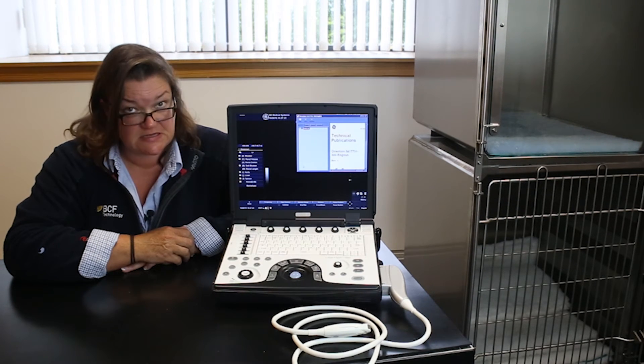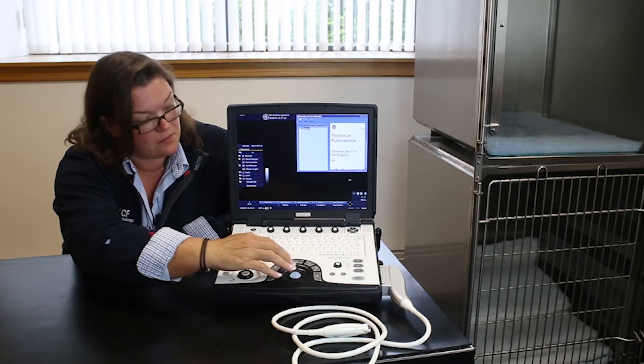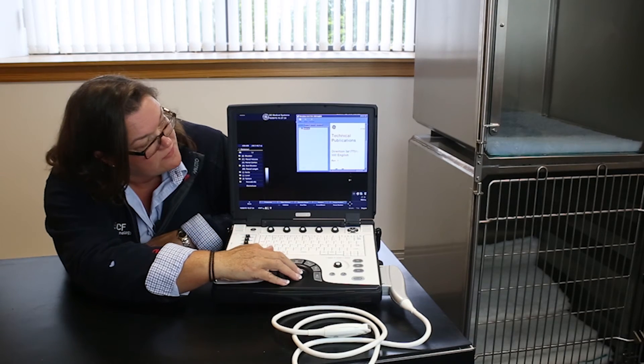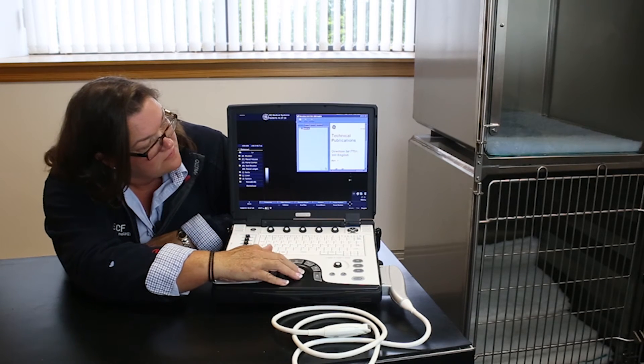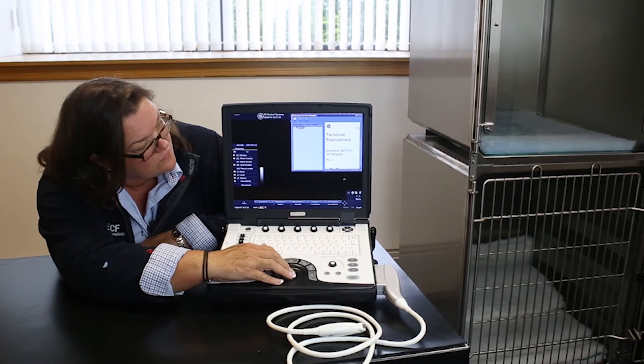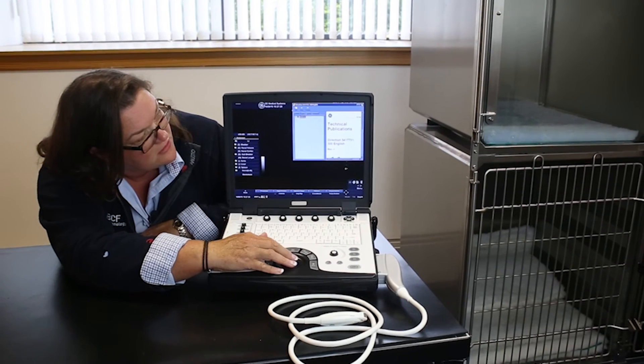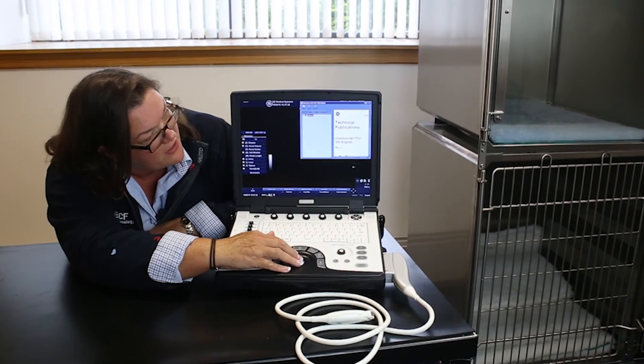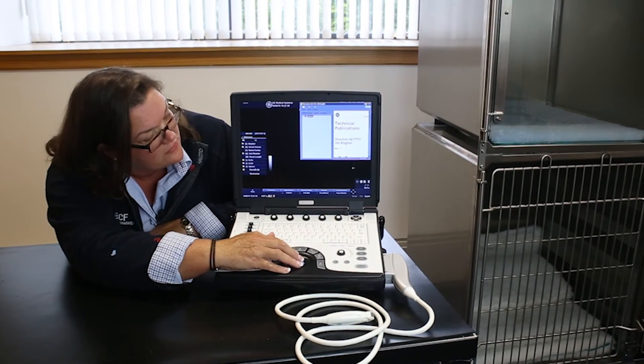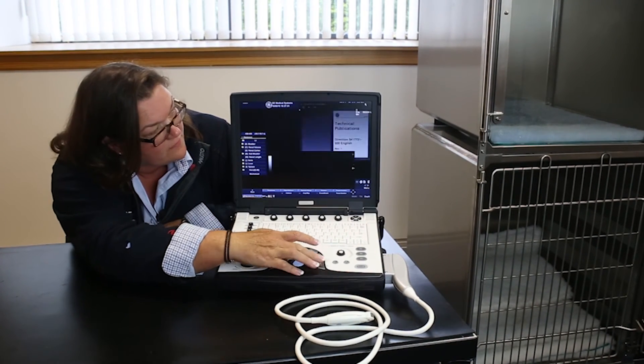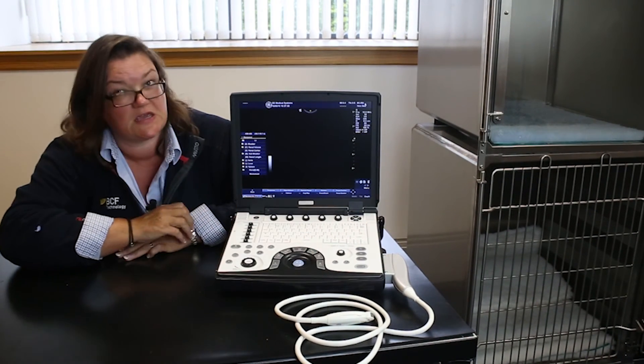To exit, just the same as on a PC, you take your cursor up to the top right hand corner and hit the X key.